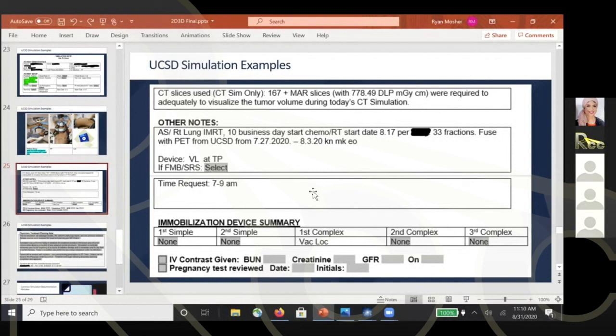There's also something called netting. It's a material that wraps around the patient. It keeps everything stable. That definitely helps us facilitate keeping the breast tissue in the same position as well. So we use tape, we use netting, and then sometimes the doctor will request that a bra is used so long as there is no metal in it. Those three things definitely help keep large-breasted patients in the correct position.